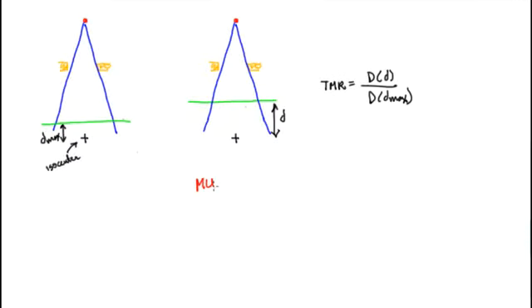Okay, here we go. So the goal here is to calculate the number of MU, that's the number of monitor units. Remember, the monitor unit chamber is that chamber in the head of the linear accelerator that monitors the dose. And so given the dose and the TMR, I should be able to find out the MU, so I can program into the machine to deliver a certain dose. So there's a simple formula for this. So we just take it equal to the dose in centigray. Remember, this is the dose at this point, at the isocenter point. That's what we're calculating for right here.